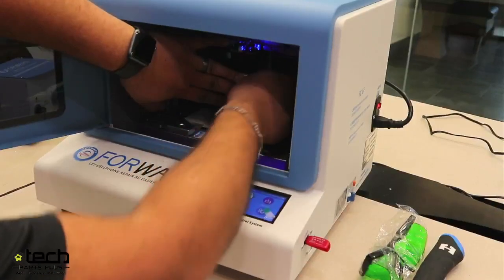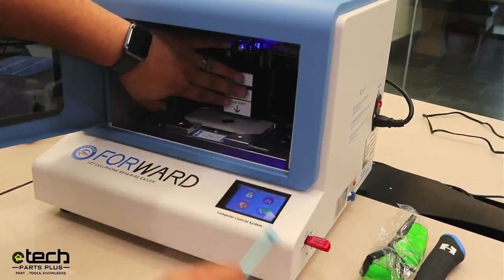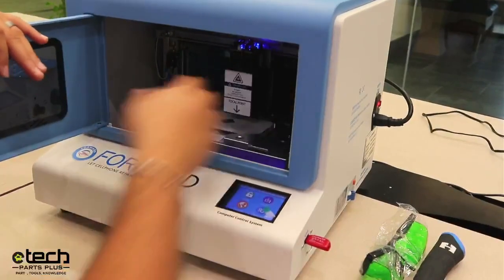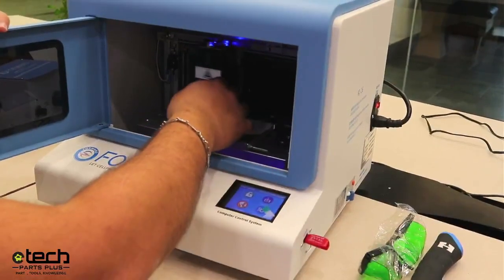Tighten the focal point thumb screw and then you're good to go. You don't have to over-tighten it — just make sure the laser head isn't going to move on you.